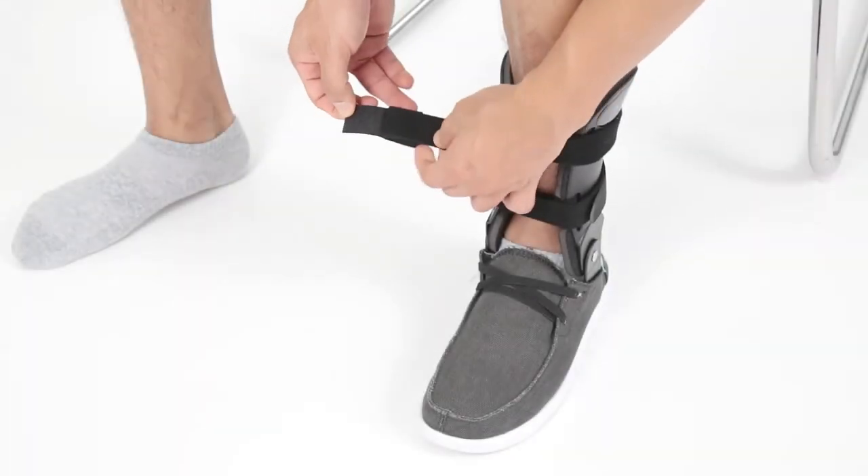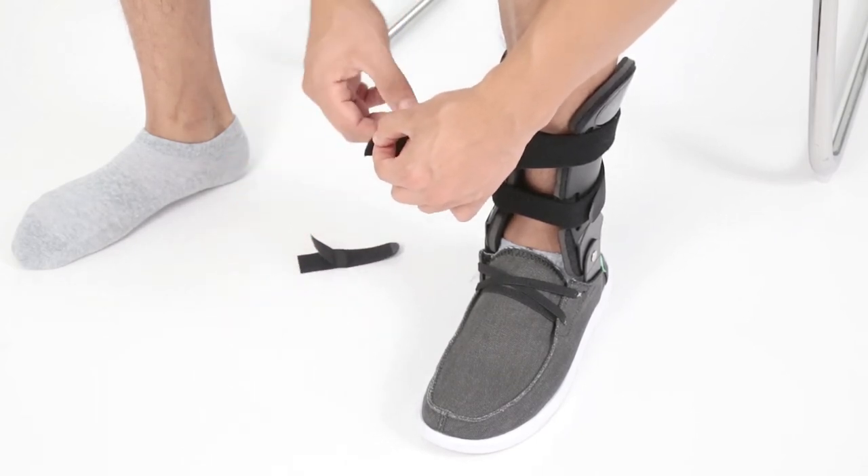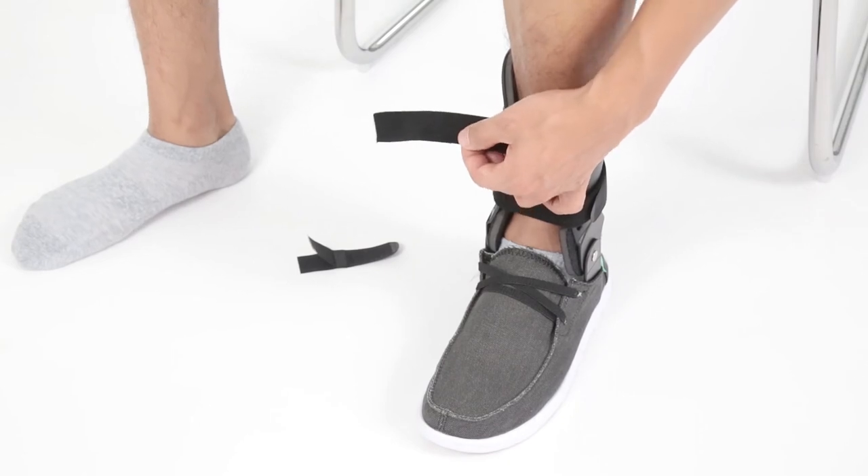You also have the option to remove the end strap connector, trim the strap, then re-secure instead of folding it over.